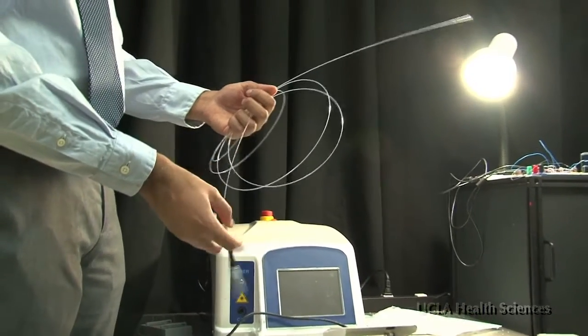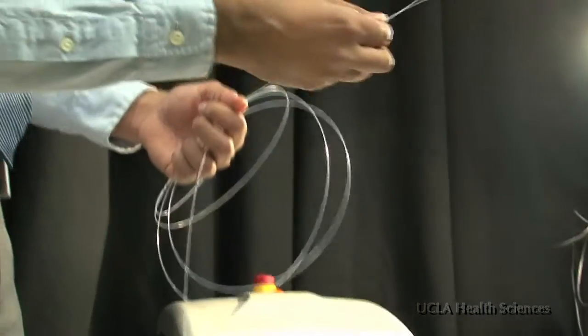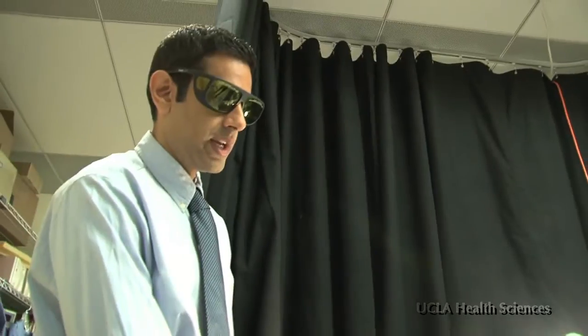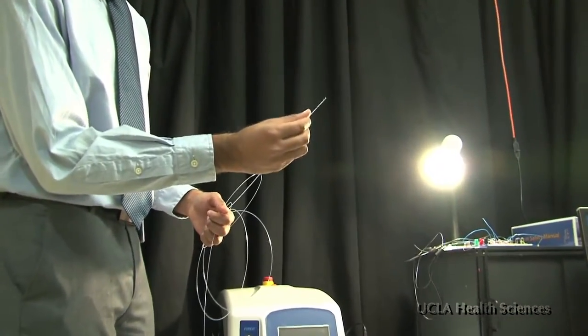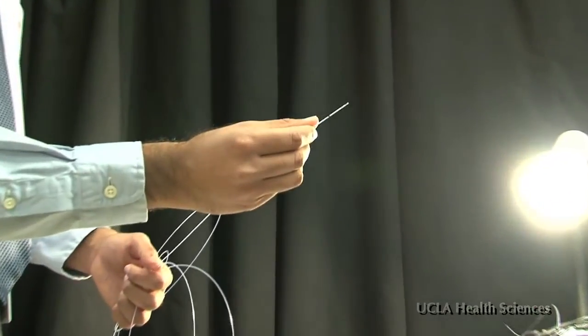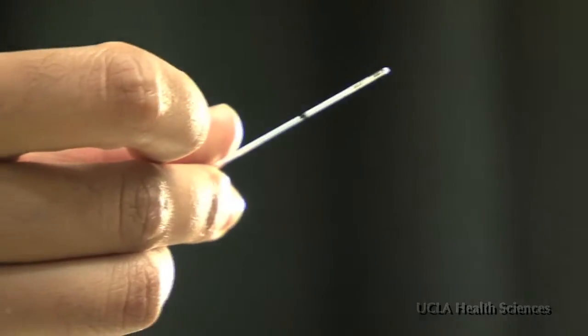This is a laser fiber that we use to ablate prostate cancer. The end of the laser fiber contains a device called a diffuser, which, rather than focusing the energy on a single point, spreads the energy out like a light bulb.